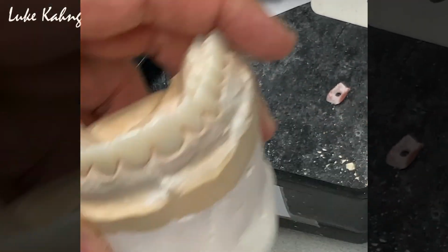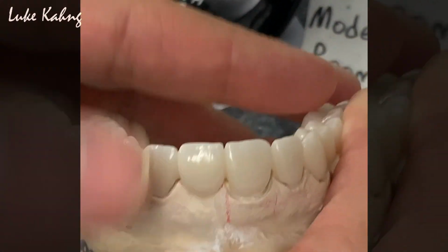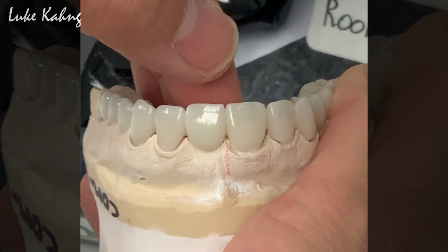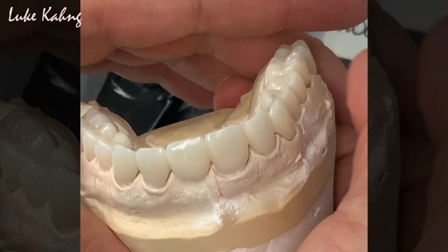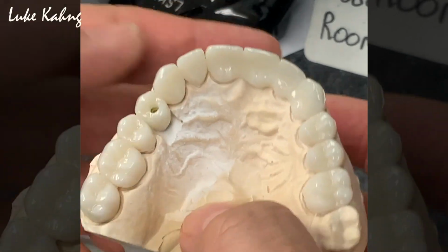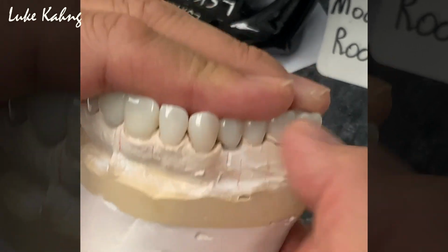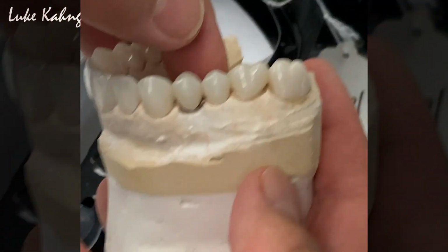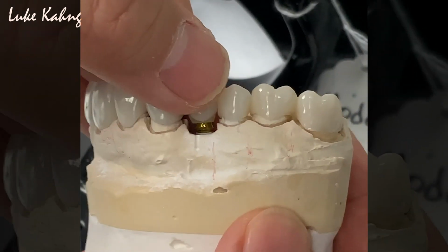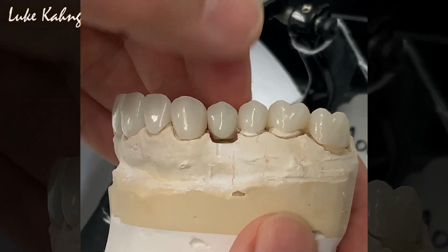Okay. And then these are the uppers, we designed it, same thing. Remember, we made the 4 unit bridge on top of that. They make the beautiful pontic, nice contour. And then we make a great buccal corridor for this. So screw retained, which is great. Just like that. So after we polish it carefully, we anodize it just like our technique, like this. Then we're going to cement it, so it will be one piece.